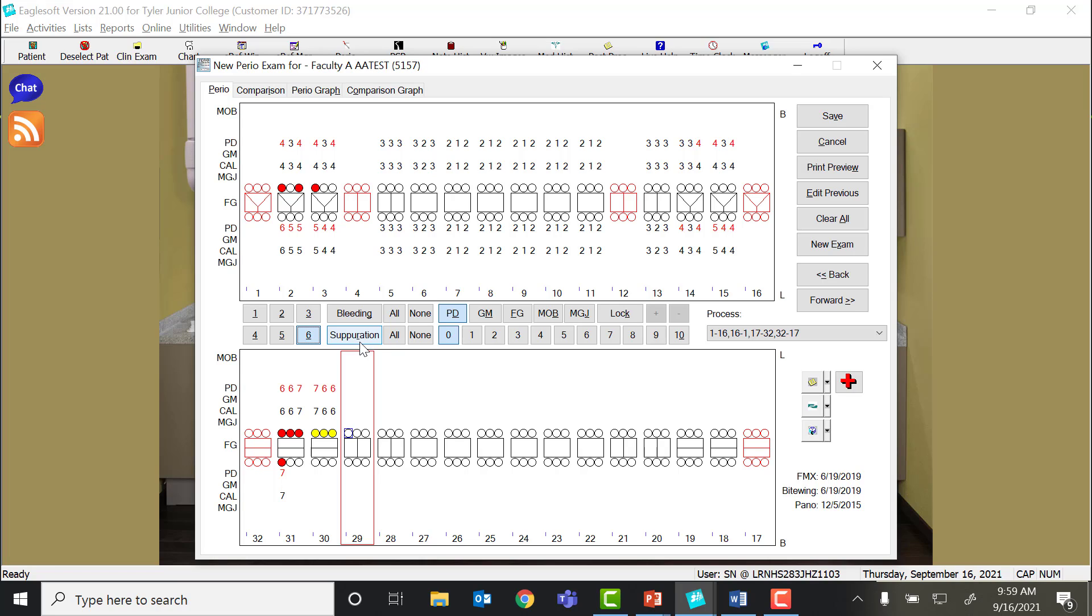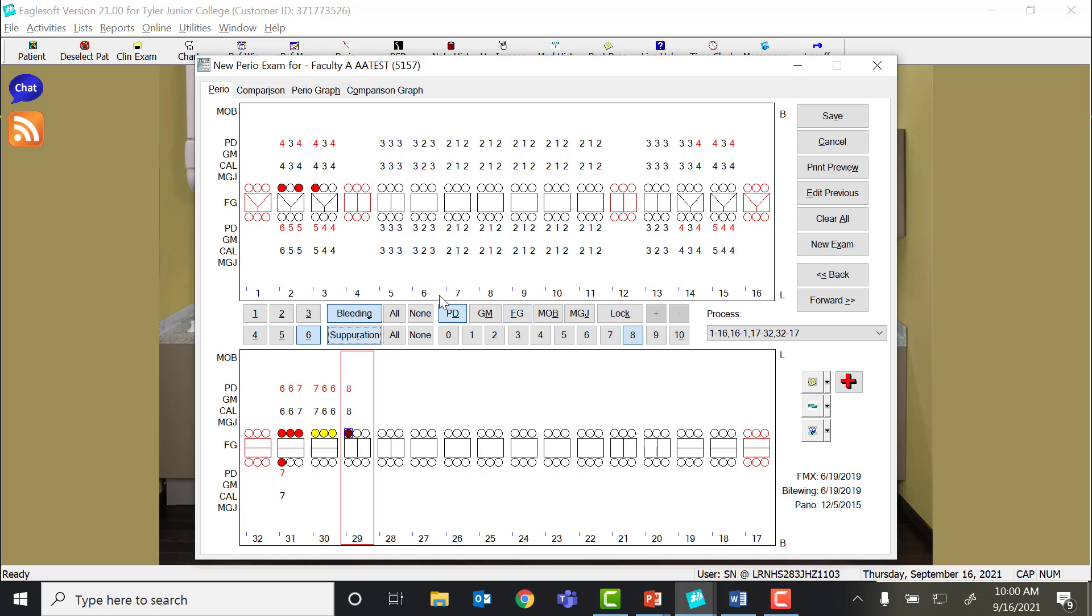If the patient has both bleeding and suppuration, let's say we have an 8mm pocket here, and the patient has both, I can click bleeding and suppuration, and then it turns a dark purple. So when all of this is complete, I should be able to tell exactly which areas were bleeding, had suppuration, or a combination of both. As a shortcut, you can also click the G and the R at the same time with the number, GR8, and it will put that in there as well.